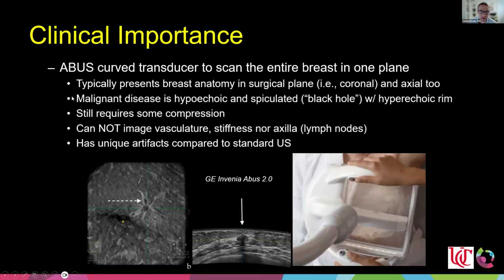There have been recent publications over the last 4 or 5 years demonstrating a new technology, which is a large field of view area ultrasound system. To my knowledge, there's only one on the market that you can purchase. But what it demonstrates is the importance of ultrasound in trying to make it more beneficial for breast imaging in general. In this one product, here you can see that it is a full field, large area ultrasound system.